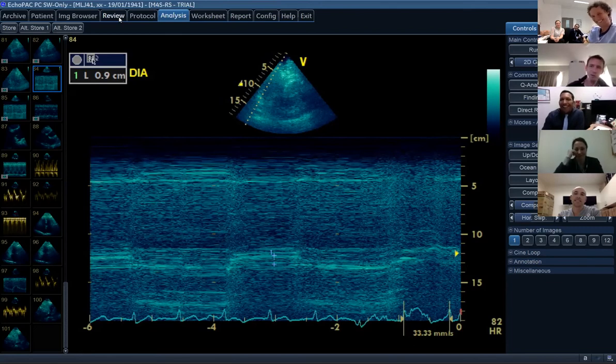The diaphragm is moving. It's all fine. I'll play that. So, it's a really great call talking about the diaphragm. I have exactly the same problem where you've asked someone to have a look at it and they say, oh, it's moving loads. Then you turn up the diaphragm and it doesn't move at all, which is why you've got to look at the thickening, because obviously the diaphragm will move with positive pressure ventilation, but it won't thicken if it's dysfunctional. So trying to do both is useful.